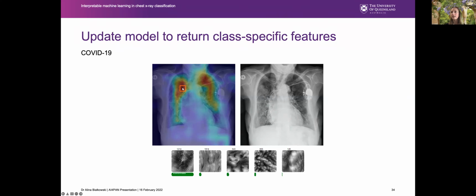The only catch is doing it wide scale. On a data set, the chest X-ray 14 data set is around 60 gigabytes. Even just processing that all with the neural network takes on the order of a couple of hours. If you introduce perturbation methods, they're probably on the order of 8 times more expensive. So something that might take a day is going to take 8 days. Admittedly, computing resources are increasing quite significantly, so it's definitely a possibility. From my own research, you want results relatively fast, but that is one of the things that we're looking at in the next phase of chest X-ray analysis.